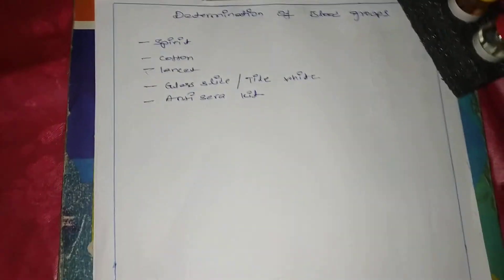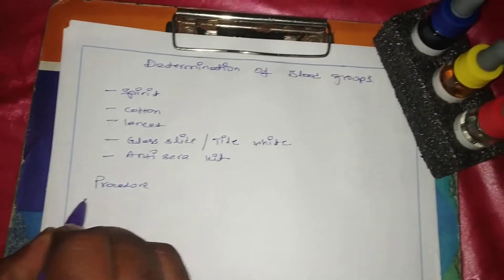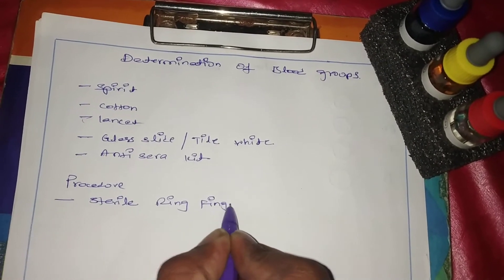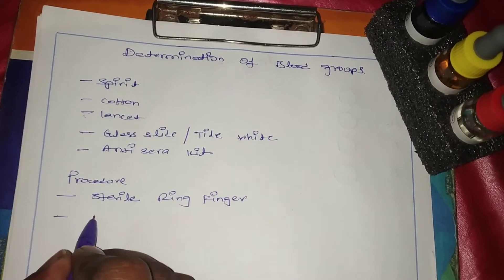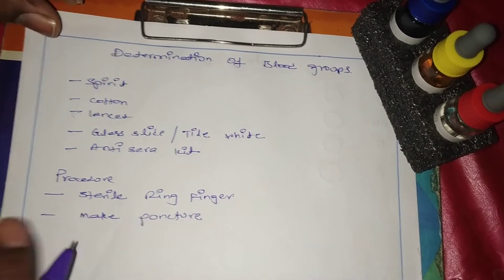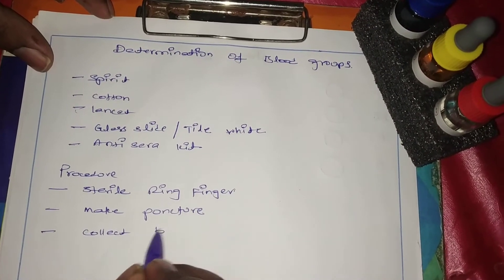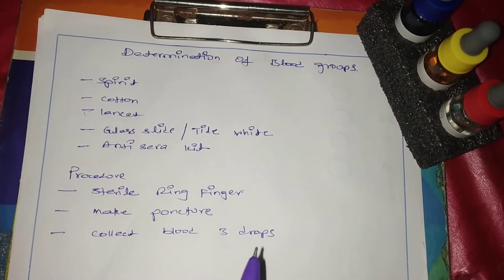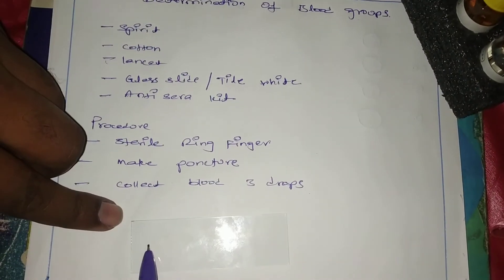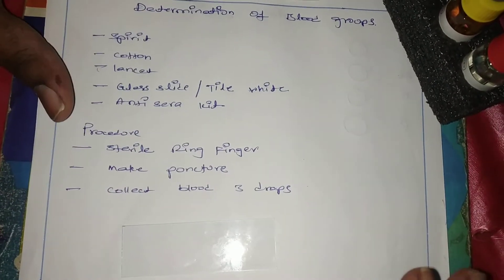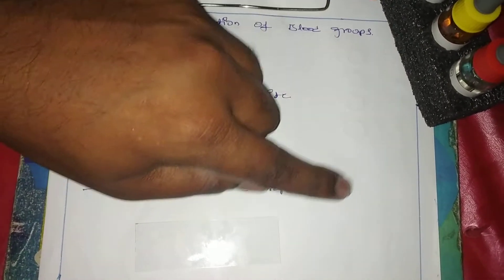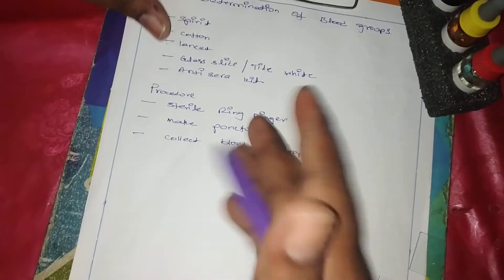When you go for the procedure, first sterilize the ring finger. Make a puncture with the help of the needle. Then collect three drops of blood separately. If you are doing it on a single slide, collect one drop here, one here, and one here. If you want to use separate slides, take three slides and collect the drops separately — one for anti-A, one for anti-B, one for anti-D.